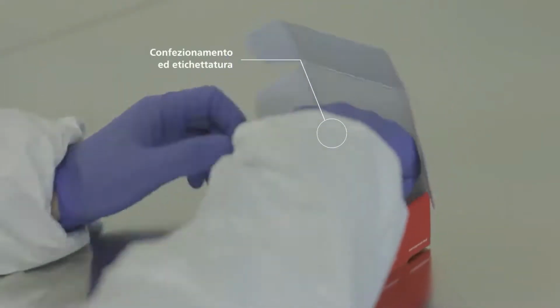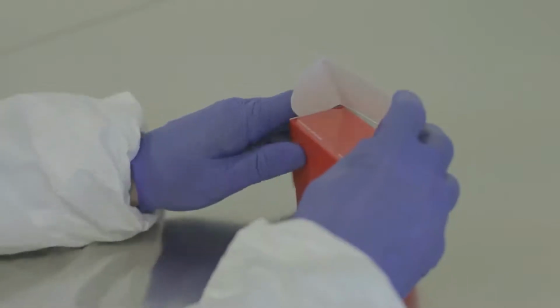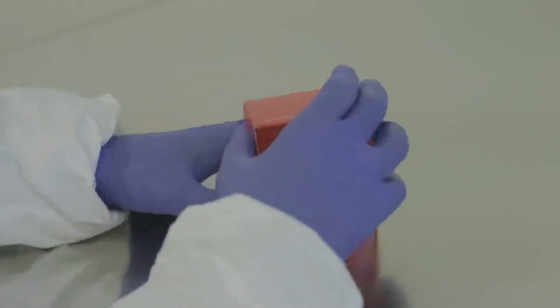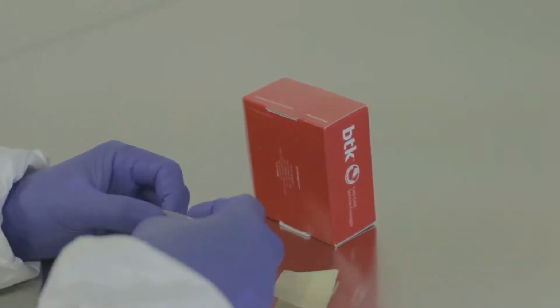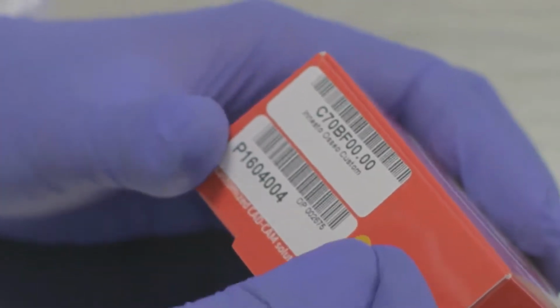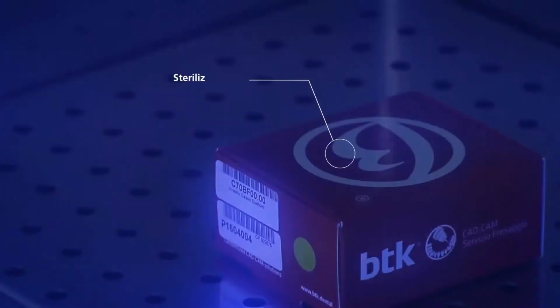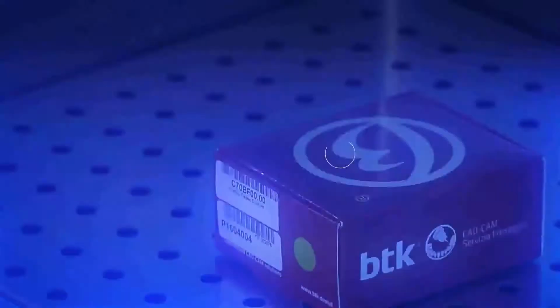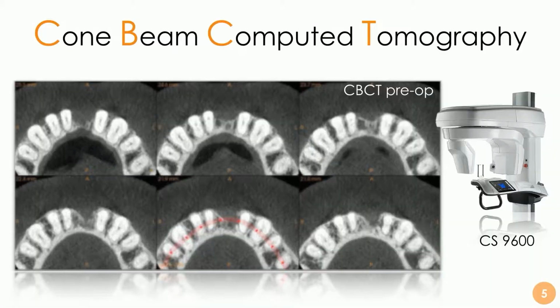We are talking about small defects, because obviously we cannot pretend to regenerate huge defects, because the key is perfusion. As Professor Ripamonti from the University of Johannesburg, where I had my thesis, always said, angiogenesis is key for osteogenesis. So if we don't have enough perfusion of the scaffold, there will be a failure. But luckily, everything is controlled in the computer beforehand, and we can also control the thickness and the volume of the regenerated bone, so we can plan it very well. If you consider that there is the possibility to have a customized scaffold, then we have a huge advantage. Why?